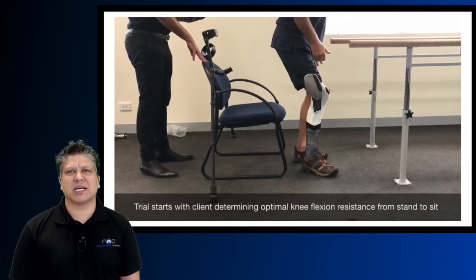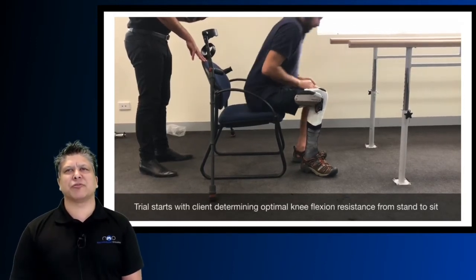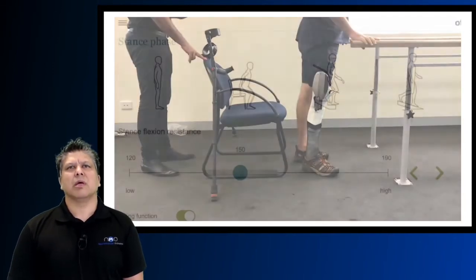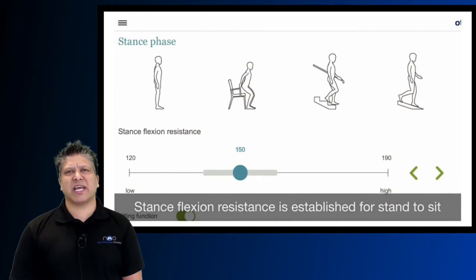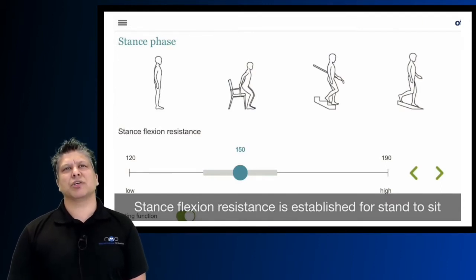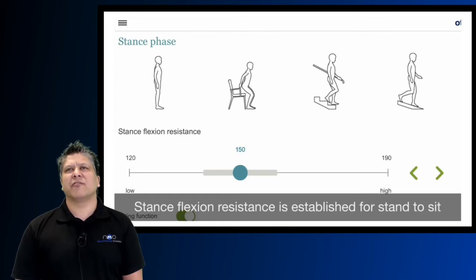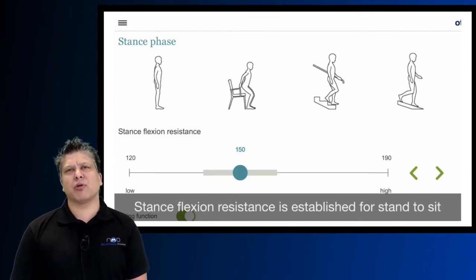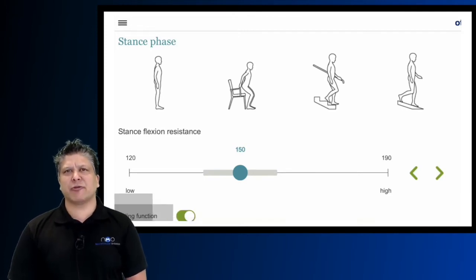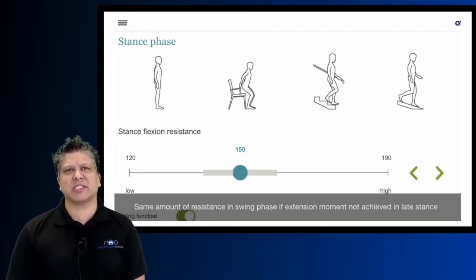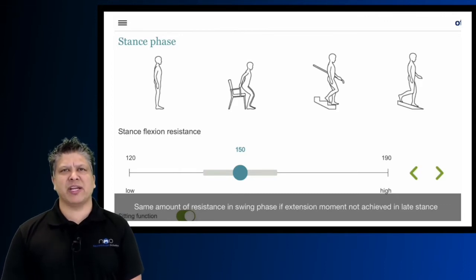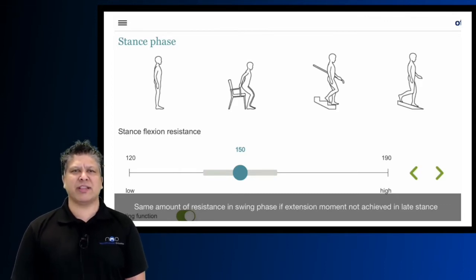The first client trial starts with determining optimal knee flexion resistance from stand to sit. This particular stance flexion resistance unit is also the same unit of resistance for standing, descending stairs, and descending ramps. It's also an important measure because if your client doesn't reach an extension moment in stance phase, this is the same resistance the client will experience in swing phase. So they won't achieve free knee flexion in swing if they don't hit that extension moment.